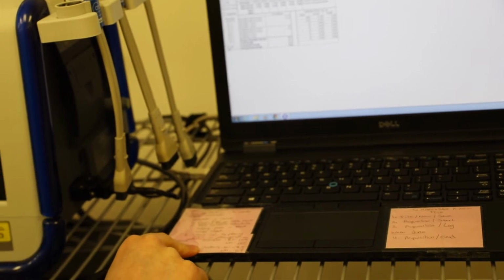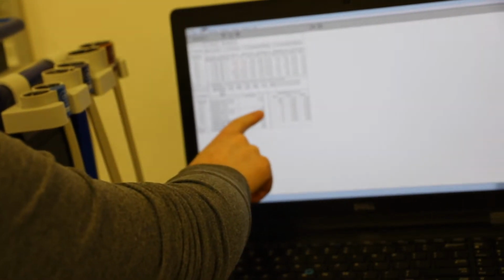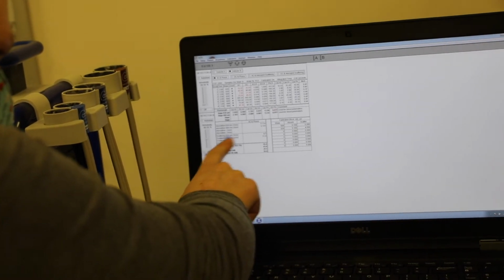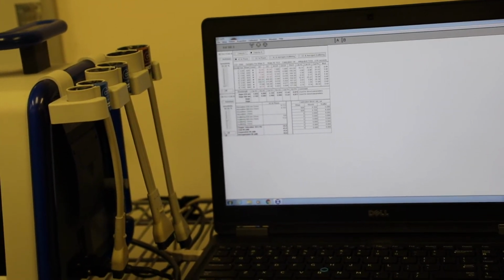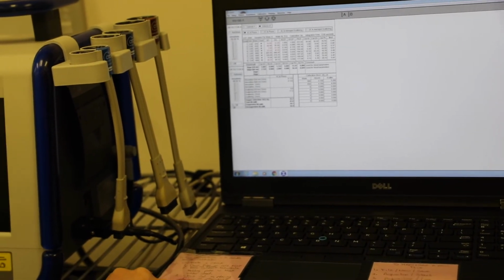Then we also want to check the scattering values. So scattering for 830 should be reading at 9.7, which it is. It's pretty right on. And then the scattering value for 684 should be reading at 10.9. And here it's reading at 11.6. So again, it's a little bit high, but it's pretty close, so it should be okay.